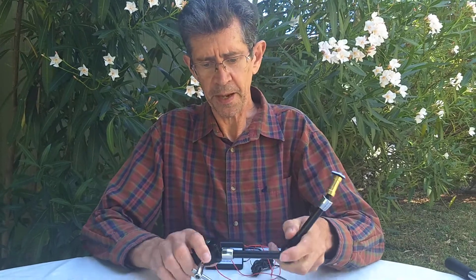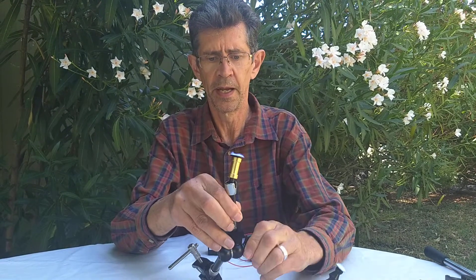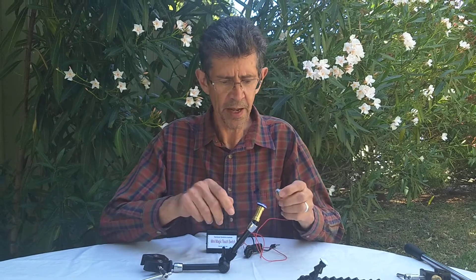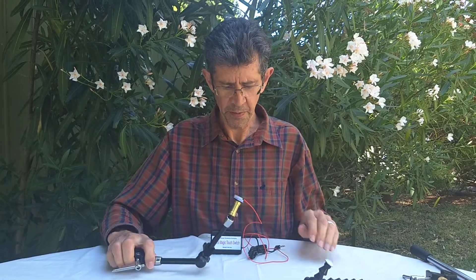The third mount is our new mini articulated mount. It comes with a clamp and has three joints. The one locking wing nut in the middle locks it all together. It can be clamped onto a bed rail, a wheelchair, a chair, or a desk. We can velcro the sensor on the end and we have another very useful mount.